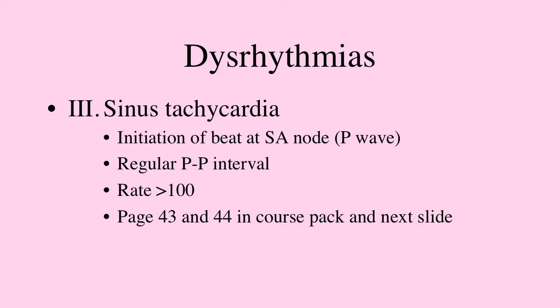Let's look at the next slide before we look at page 44. Again, everything's normal, but there's just a fast heart rate greater than 100. If you look on page 44 in the course pack, this is a very fast heart rate, and this is one case where sinus tachycardia is normal in a baby. This is a 1-month-old baby, and the heart rate is very fast.